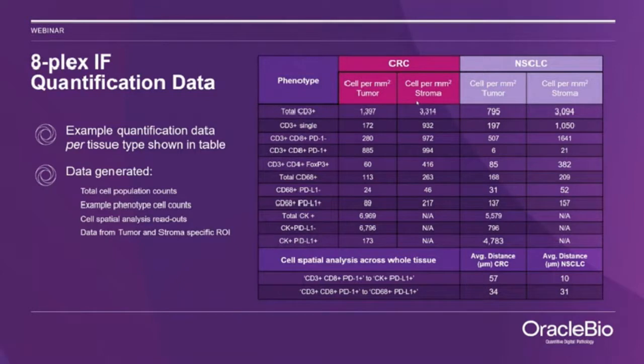Now, this is just a selection of the phenotypes from two sections, but you can certainly imagine that if you're performing a clinical study or a study that has tissue microarrays of up to a couple of hundred cores, then you're going to generate a lot of valuable data that can also be added to with either the patient information, the trial information, or even the therapeutic response data to enable an evaluation of proof of mechanism based on therapeutic response, or a stratification of patients based on a particular profile that the data presents. So lots of ways to mine this data to support your studies.